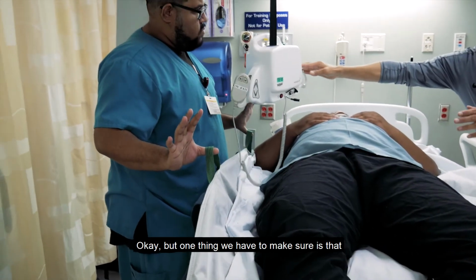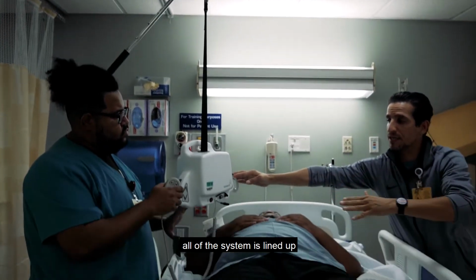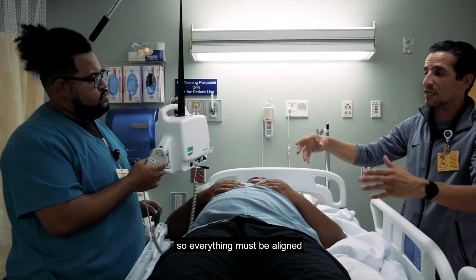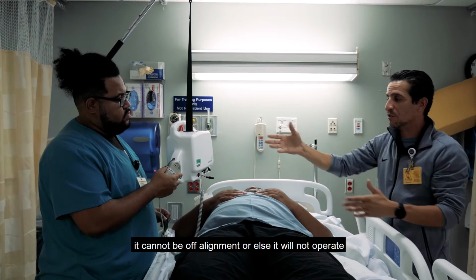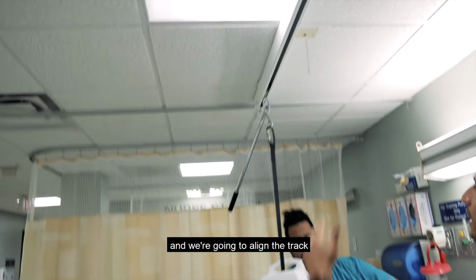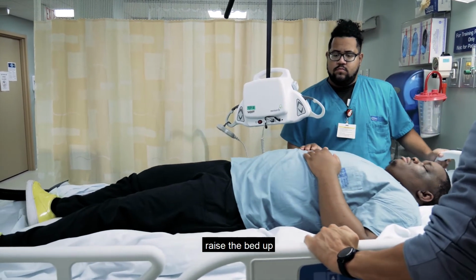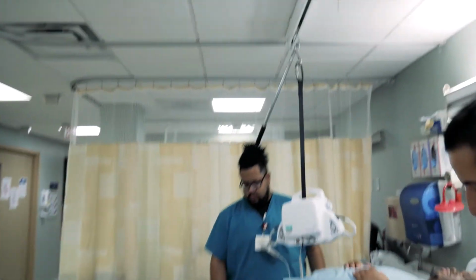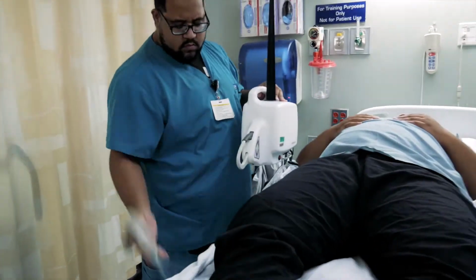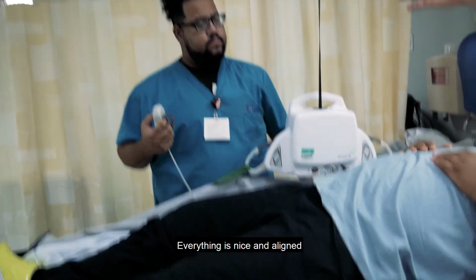Okay, but one thing we have to make sure is that all of the system is lined up. The ceiling lift has a tilt switch on it, so everything must be aligned. It cannot be off alignment or else it will not operate. We're going to push the bed and we're going to align the track pretty much to the waist of the patient here. So we'll raise the bed up. Excellent, that should be good there. Lock the brakes and he's going to attach it. So as you can see, we're aligned here. Everything is nice and aligned.